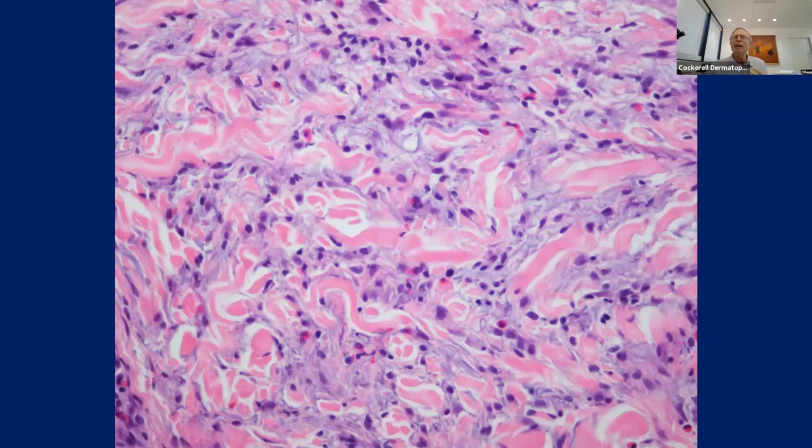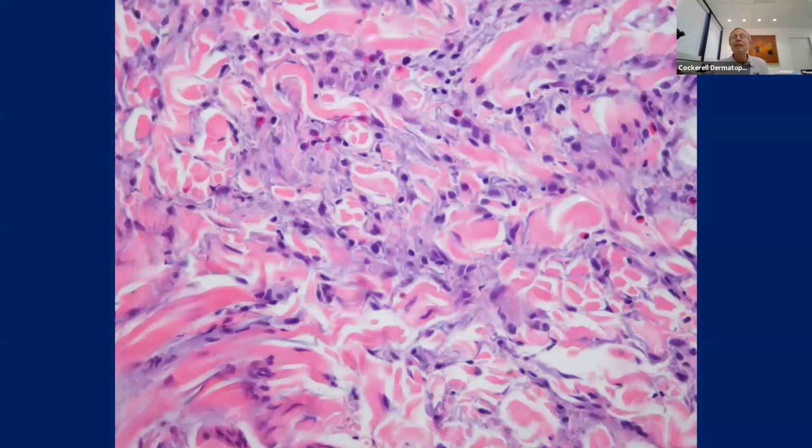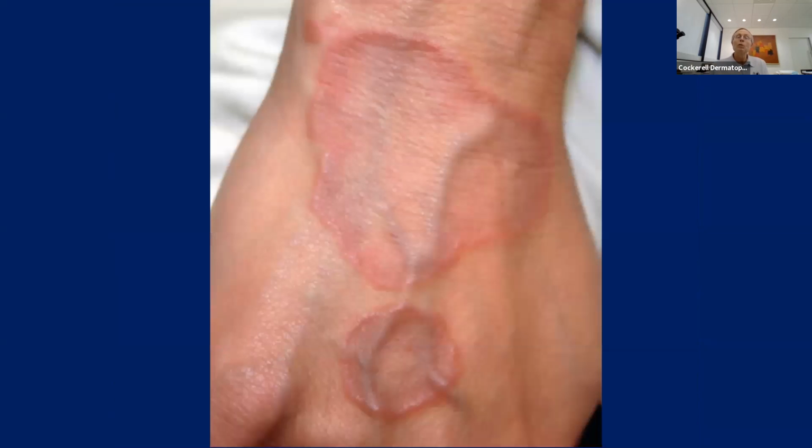And most of the drug-induced GA, I'm not really sure it's drug-induced GA. It's probably more of a granulomatous GA-like drug eruption that we see. And most of those actually don't have eosinophils in them, but that's not a bad idea to think about. Just realize that rarely, sometimes in GA, you can get eosinophils. So just remember that. I don't think they would show you this one on the board examination because it's a little bit tricky, but just so you'll know, it's a little bit of an unusual pattern and it probably didn't look like this clinically.